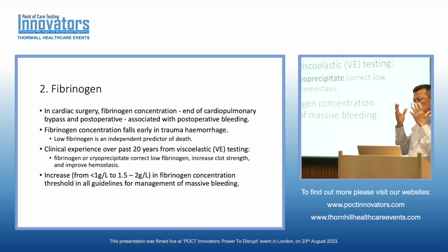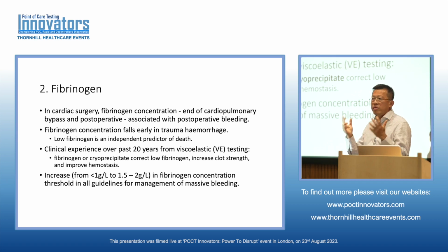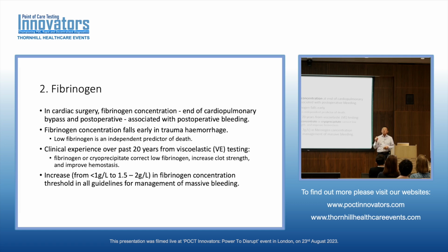Just to show you that what you need to do is not to guess whether your patient has a coagulopathy or not, but to check and measure. And the next thing is to give what's needed. So think of viscoelastic testing as like a blood gas analyzer. No intensivist will go and see the patient and say, I guess the patient's CO2 is so much, I guess the patient's PO2 is so much, or I guess the patient's creatinine is so much. You say, just measure it and find out what the result is. Oh, creatinine is high, AKI; CO2 is high, increase ventilation. So viscoelastic testing is really a kind of blood gas analyzer of coagulation, objectively telling you what's wrong with the patient and what's needed.